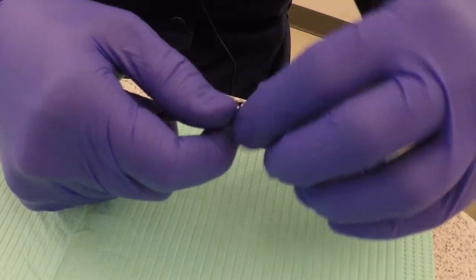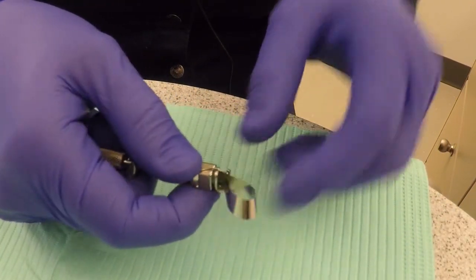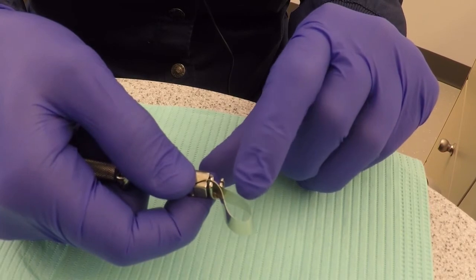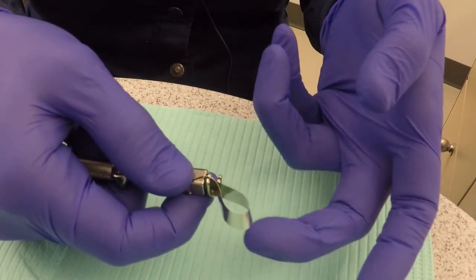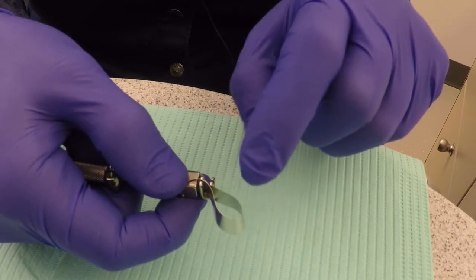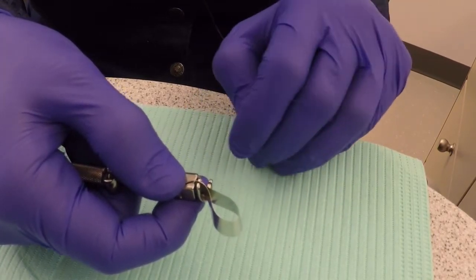We are using the right guide slots because we are working on tooth number 19. The smaller perimeter or circumference of the band will go toward the gingiva, and the larger circumference will be placed toward the occlusal. The gingival side of the band is always placed toward the guide slots.